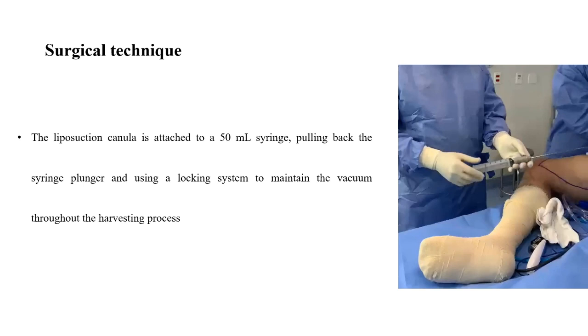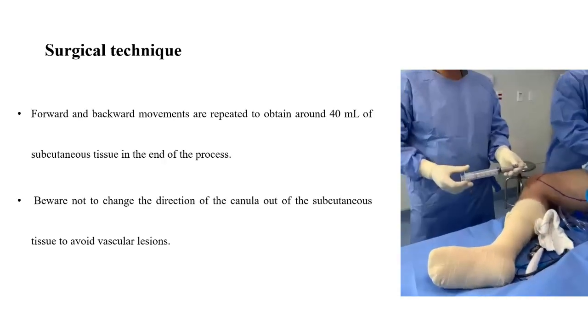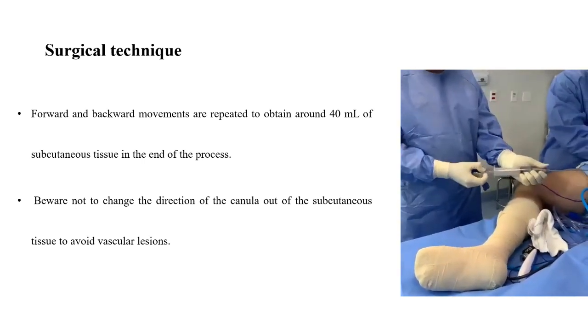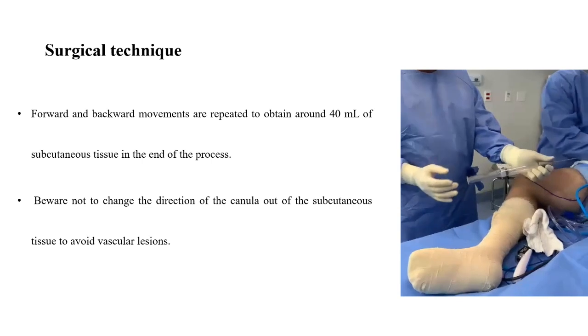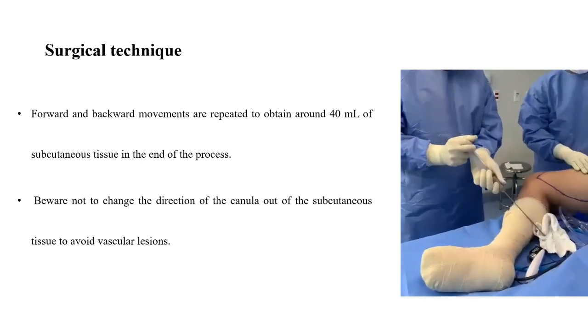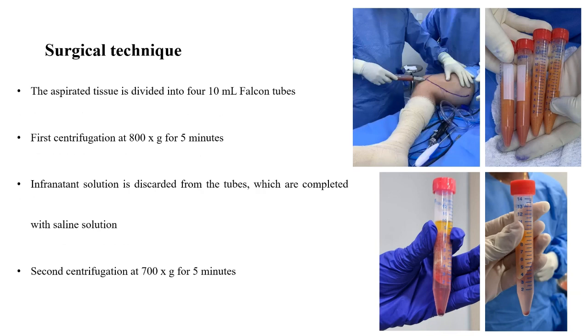Then, the liposuction cannula is attached to a 50 ml syringe, pulling back the syringe plunger and using a locking system to maintain the vacuum throughout the harvesting process. Forward and backward movements are repeated to obtain around 40 ml of subcutaneous tissue. Beware not to change the direction of the cannula out of the subcutaneous tissue to avoid vascular lesions. The aspirated tissue is divided into four 10 ml falcon tubes.